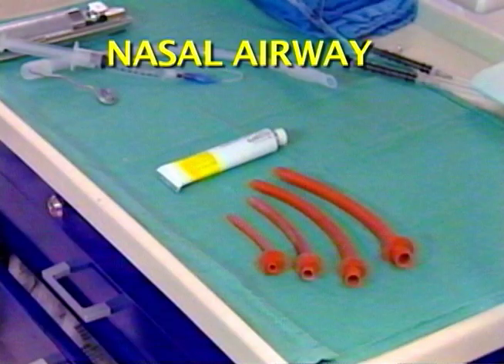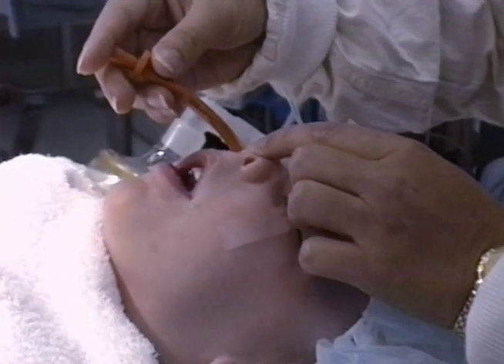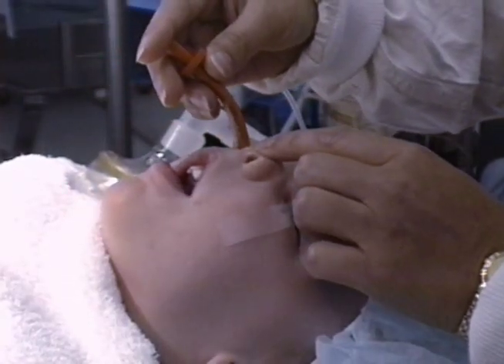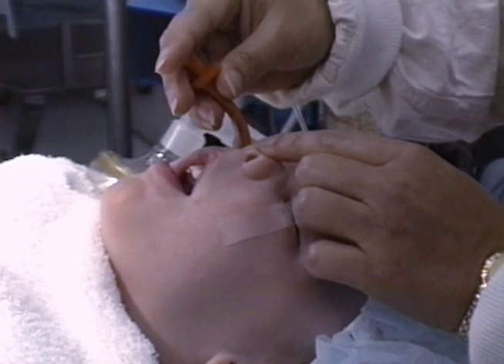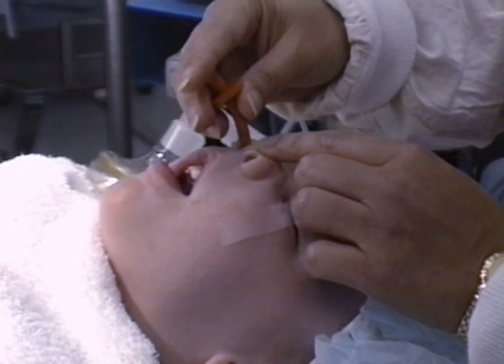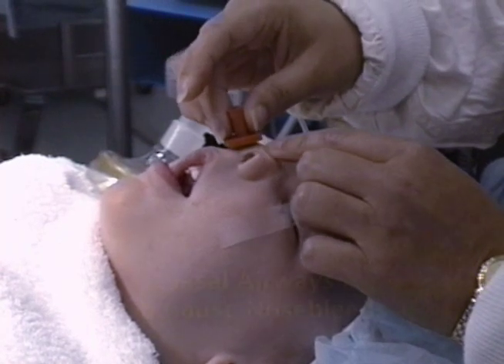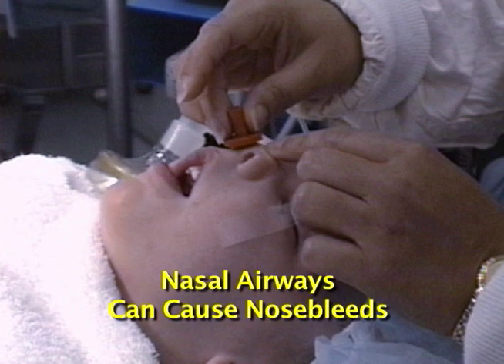Choose the largest size to comfortably fit your patient. A nasal airway is often better tolerated in semi-conscious patients because they don't stimulate the gag reflex as much. However, it must be used with caution in pediatric patients. Nasal airways can cause nosebleeds, especially in 3- to 6-year-old children with hypertrophied adenoids.